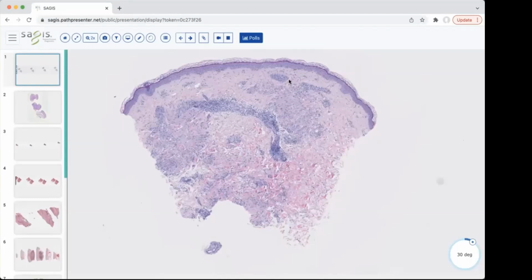A palisade is basically just a fence. So in the skin, when we're looking at biopsies, that means there's essentially a palisade, a fence, around the material in the dermis. Next is suppurative. Suppurative granulomatous dermatitis is just something that's neutrophil rich. So you'll have many histiocytes, but also neutrophils. In the skin, the most common reason for that is a ruptured cyst or follicle, but there are many other things that can cause it as well.